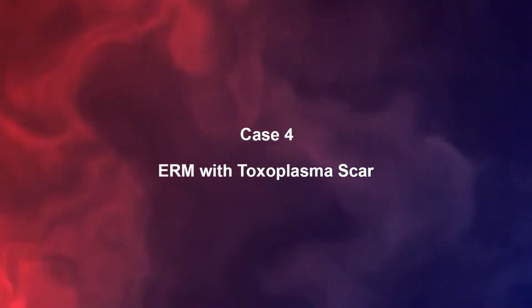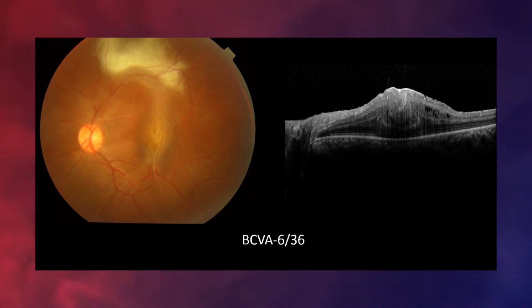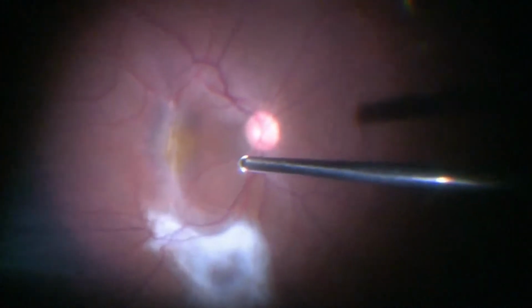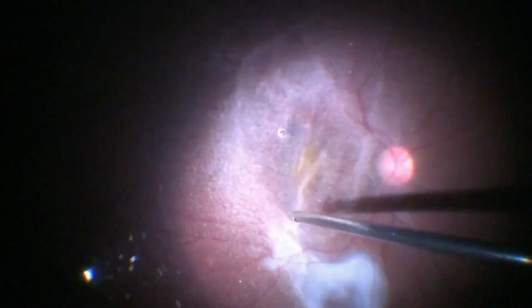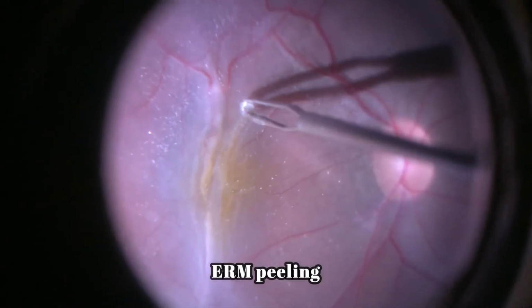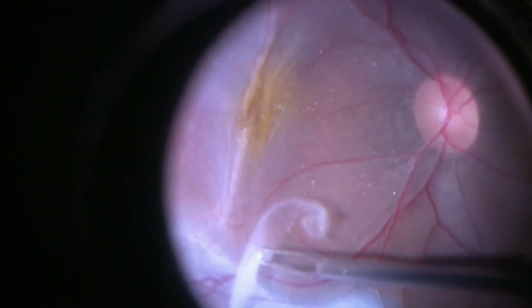In the fourth case, the wide field color photo shows a toxoplasma scar along the superotemporal arcade, and the optical coherence tomography demonstrates an altered foveal contour. The surgery was started with core vitrectomy and Triamcinolone staining, followed by epiretinal membrane peeling, which extended to cover the membrane over the hypopigmented lesion of toxoplasmosis.